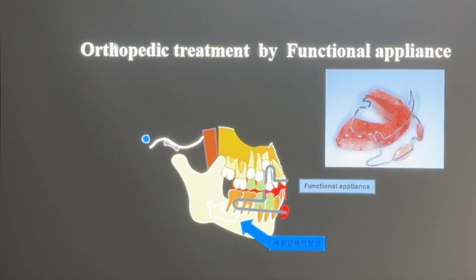Okay, it's basic. But sometimes an eruption will occur in the mouth. At that time, you need to make space over there by resin grinding. We call it selective grinding. So the basic principle of upper selective grinding is for the erupting teeth. And then you can control the eruption pathway.